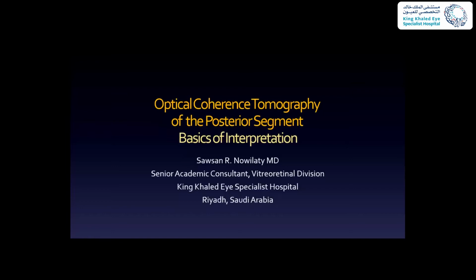All right. So today we're going to talk about optical coherence tomography, the macular OCT of the posterior segment, and how we interpret OCT. Now, I've given this course for the past few years, so it's more or less the same course with perhaps a few changes.